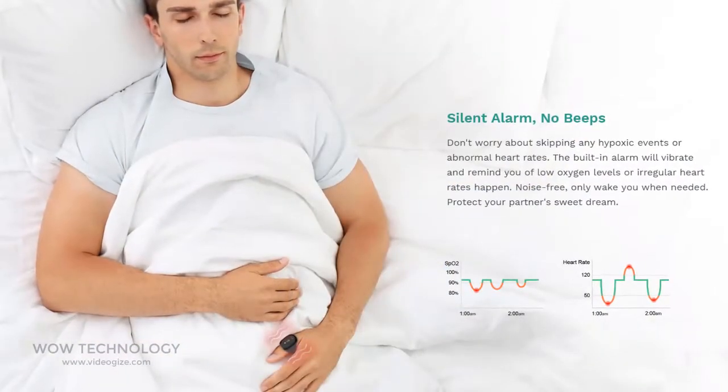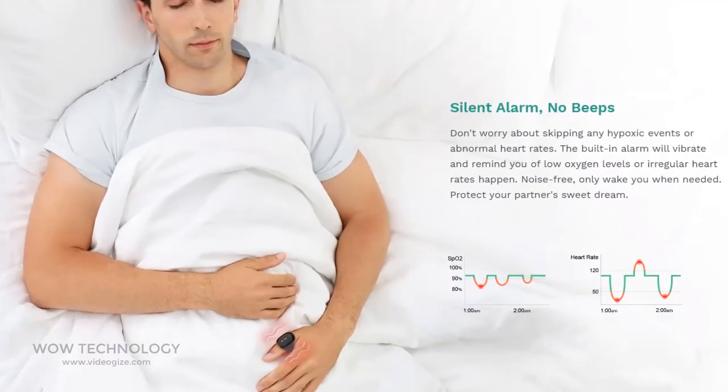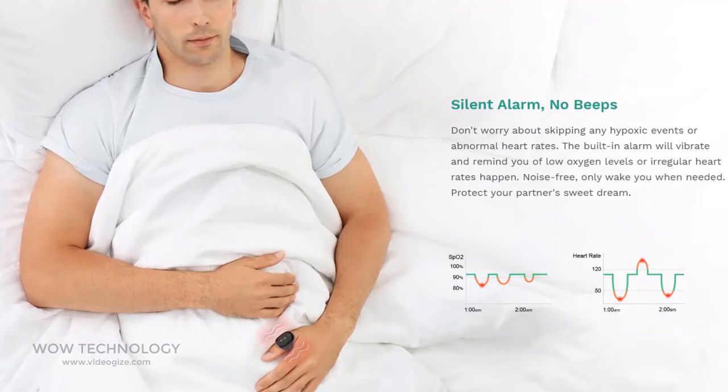When a low oxygen level or abnormal heart rate is detected, it silently vibrates, waking you up and alerting you to breathing interruptions during the night.